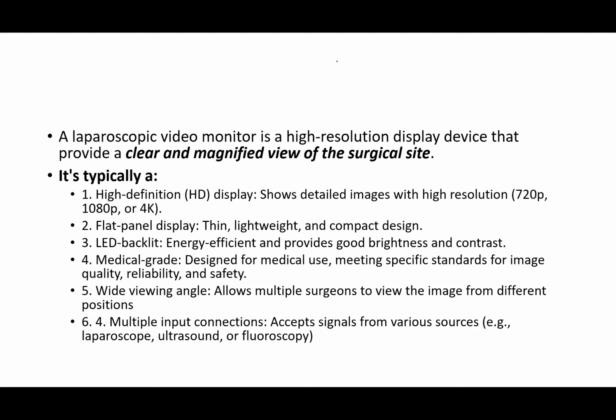So now it's a high definition display. It shows detailed images with high resolution: 720 pixels, 1080 pixels, or even 4K resolution.